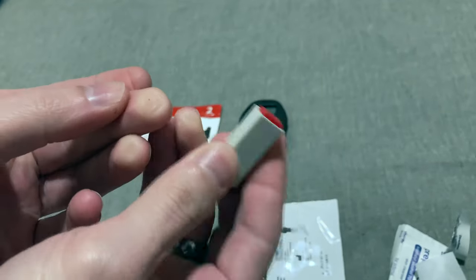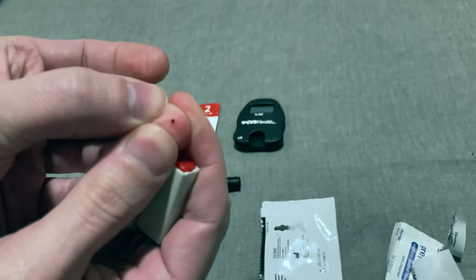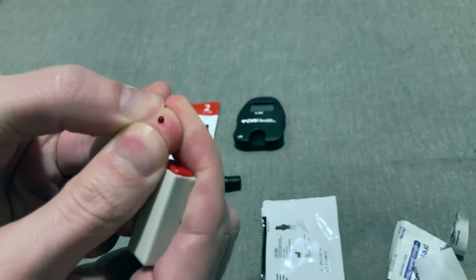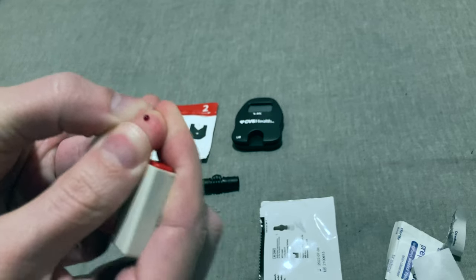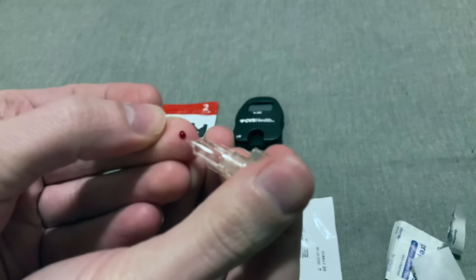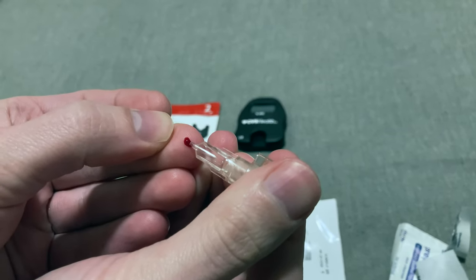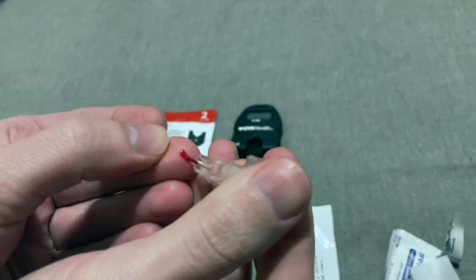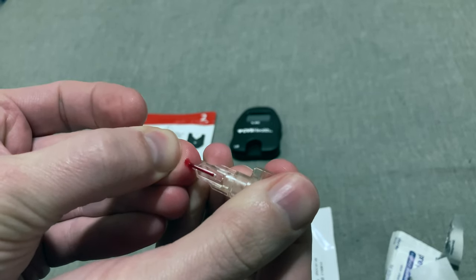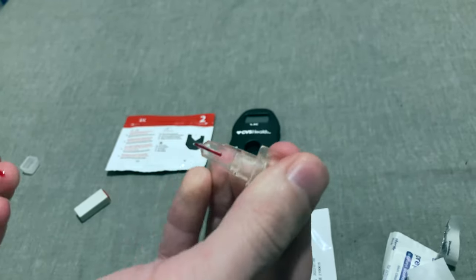And then pull out and squeeze it, a good sized droplet like this. More. Because you need a fair amount of blood for the sample taker. Now, once you have your blood here, you're going to put this into here like this, and you're trying to uptake it like that until it's full, just like that.